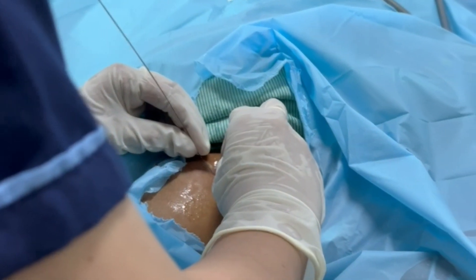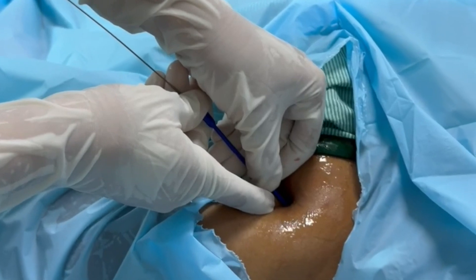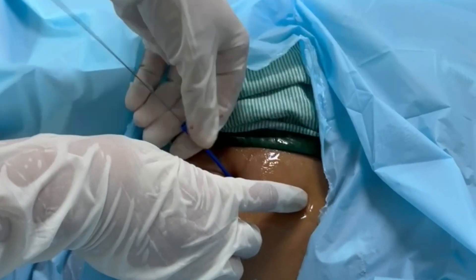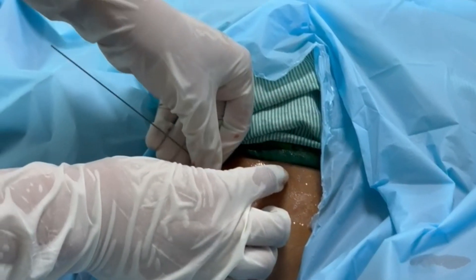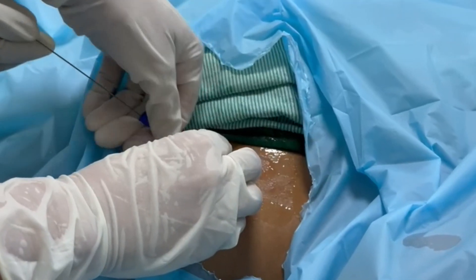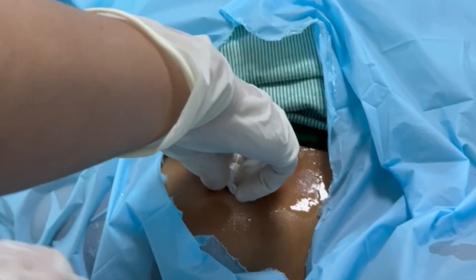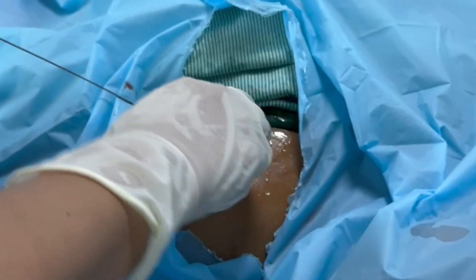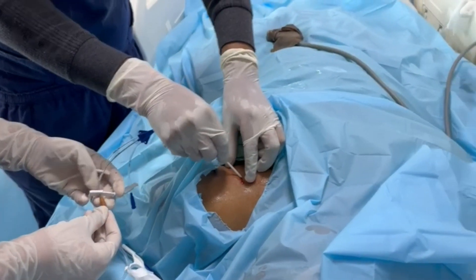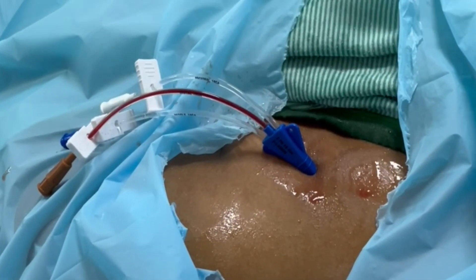Apply a nick over the insertion point of the guidewire and dilate the skin. Insert the dilator in full length, because with the pectoralis major and minor muscles present, you have to make a tunnel through both muscles. Now you can see we have placed the CVP line through the subclavian vein.